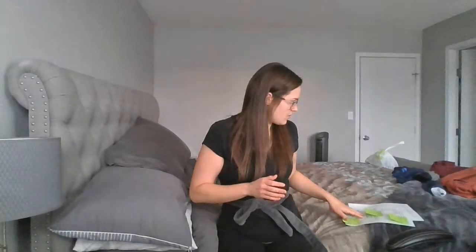So the first nurse is going to tell the second nurse, okay, this is what we're doing. You're going to have one nurse on one side of the patient, the primary nurse holding the patient and holding the belt like they're supposed to. The second will be on the other side. The patient themselves, again, need to be looking forward. And if it works, they can help push themselves out of the bed as well, just to add that little bit of stability.